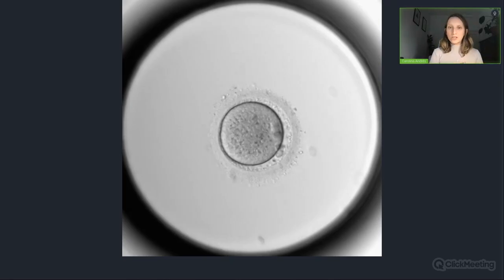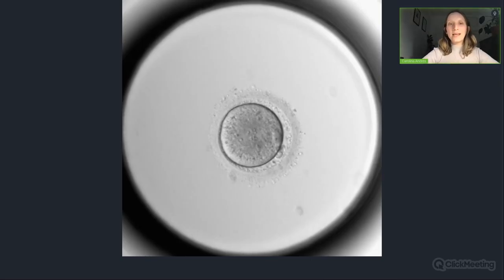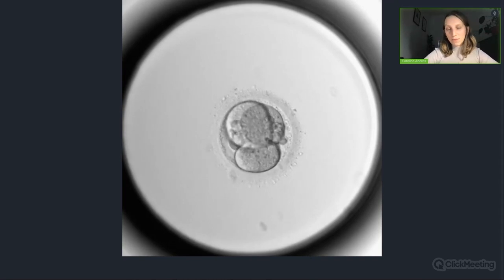But on some occasions, we see that 1 cell divides into 3 cells. That's what we call DUC. In this video, you can see that the 2 pronuclei have appeared in the middle. They have just faded, and this cell is going to divide into 3.